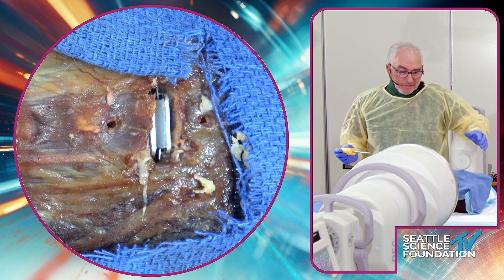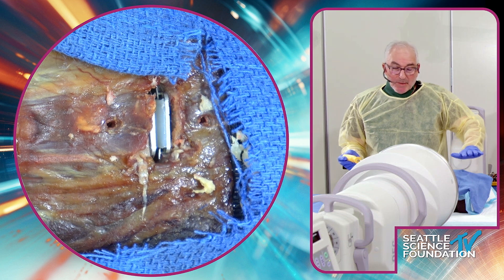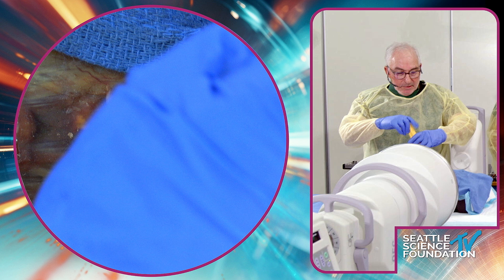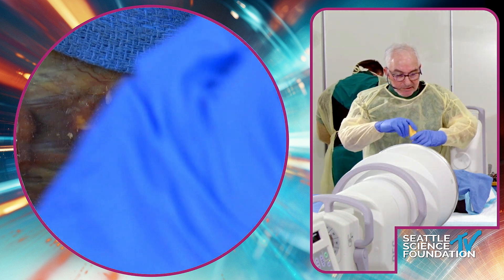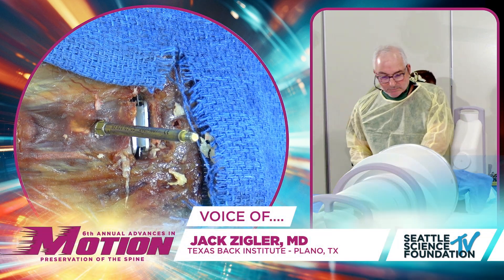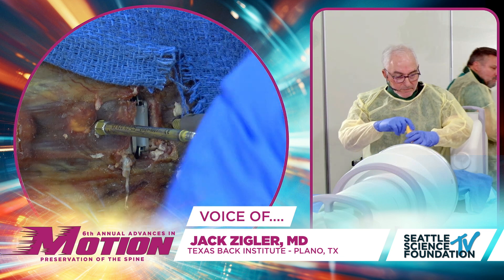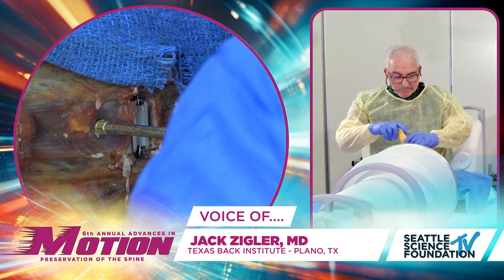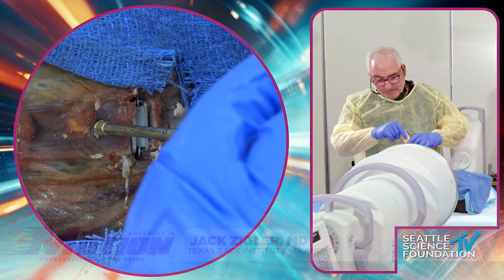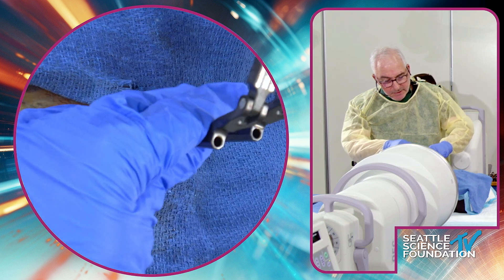Once I get the disc exposed, the first thing I want to do is distract so I can get it out. I put my pins in first. That's one of the reasons why cervical revision is a little bit easier than lumbar — we have the ability to use external distraction. We'll get a little distraction going here.